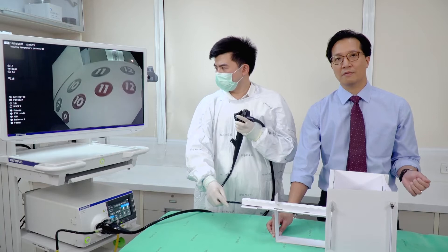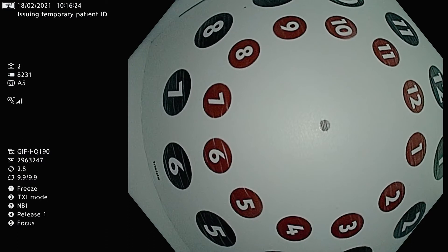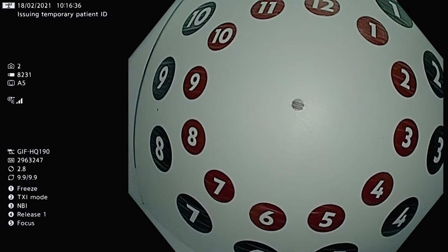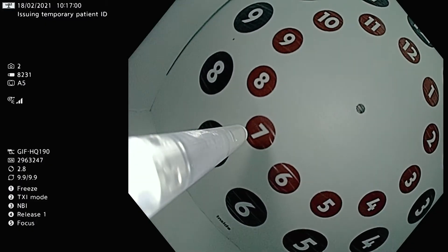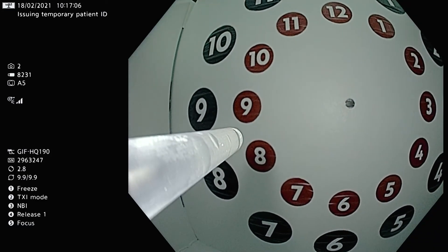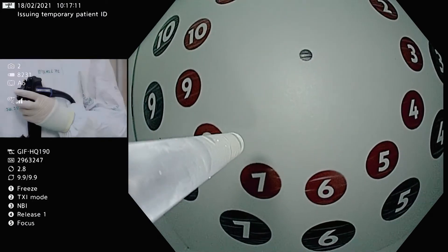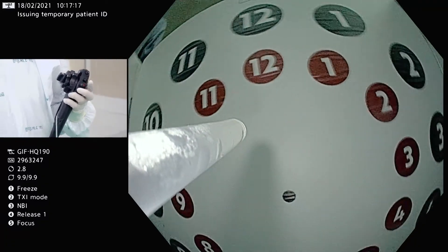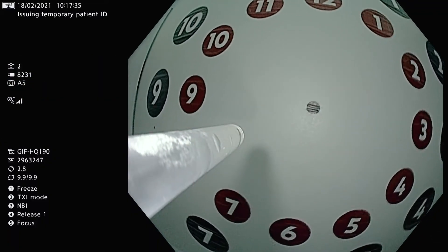So now what exercises can you do? We can practice the torquing of the scope. Here the scope is turned by just twisting the scope, and it might be easier to see with a pointer, so we'll put a needle in. I suggest you put the scope in about 50 centimeters and then we can show the movement of the scope with torquing by twisting the left hand and the right hand together.